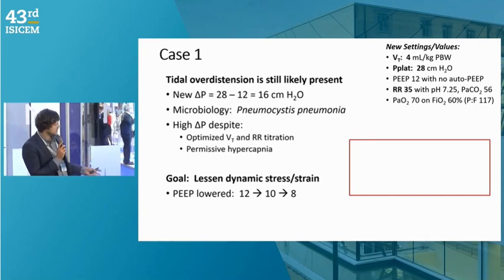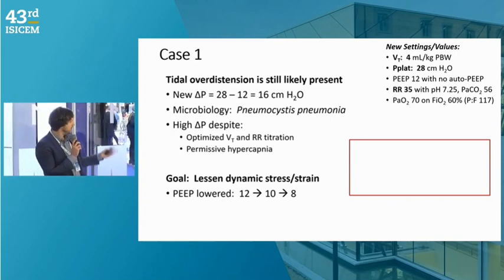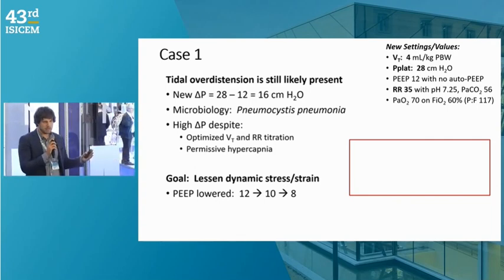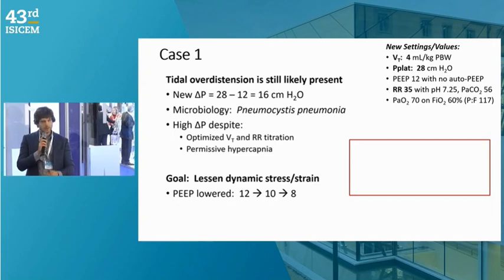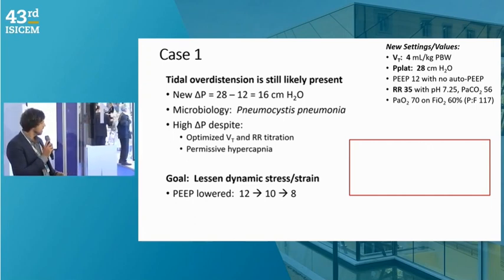And this is a little bit paradoxical because now this is a patient with relatively high FiO2 requirements, but where you have data telling you that the patient is likely overdistended. So I'm not saying that you would empirically lower PEEP, but you should try and see how the mechanics change, right? And different patients might respond differently. But I can tell you, I've been surprised, even as somebody who uses esophageal manometry, that sometimes mechanics do improve and you are actually overdistending the patient, especially patients like this that have what feels clinically like a more fibrotic lung. So if you're ventilating a patient with idiopathic pulmonary fibrosis, for instance, if you try to go up on PEEP at all, no matter how hypoxemic they are, very likely mechanics will just be incredibly deranged. You'll encounter very, very high airway pressures.